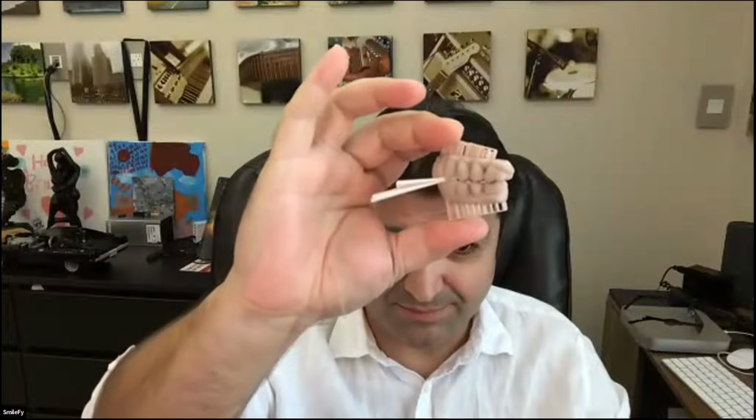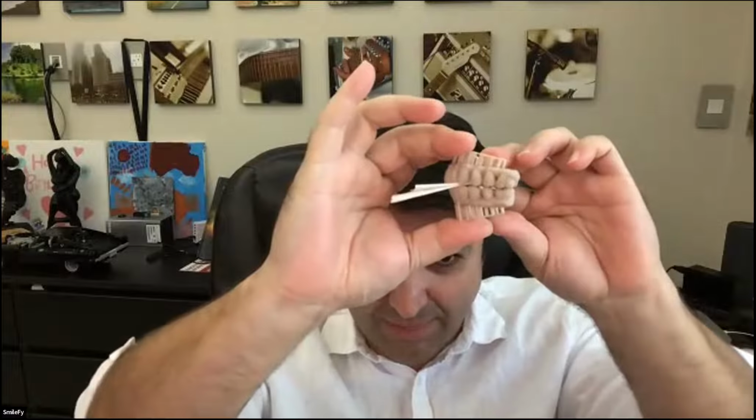Don't judge me, okay? Here, it's our bite registration. So you put the bite registration in the mouth of the patient, like this. And now we have a new vertical dimension of occlusion here, right? And then you scan the new position of the lower jaw.